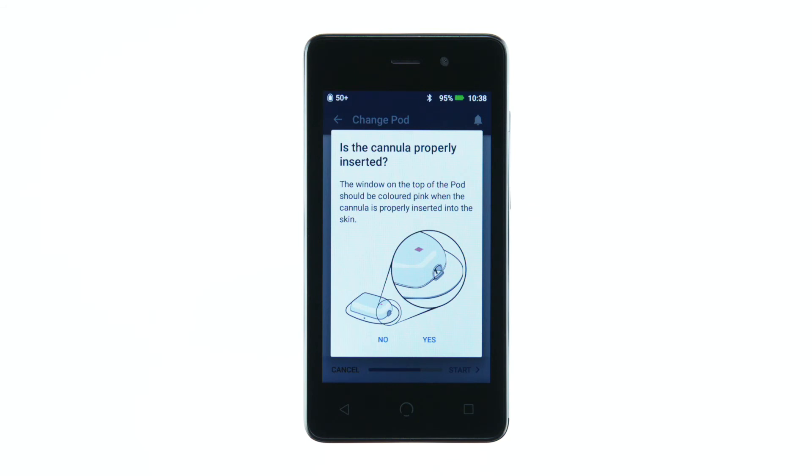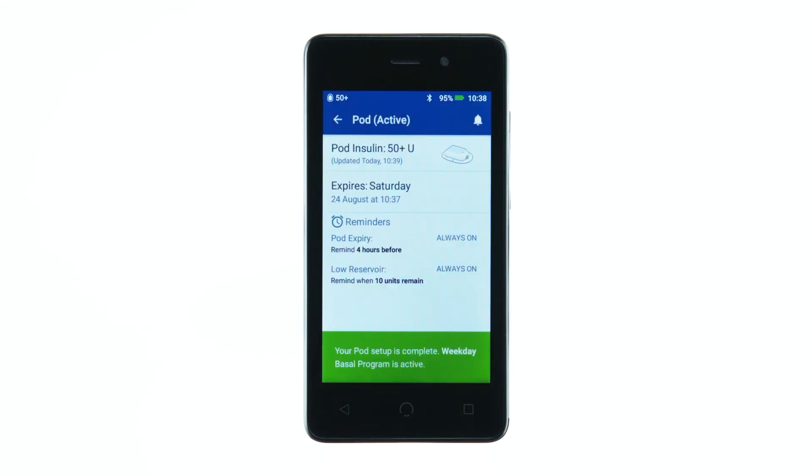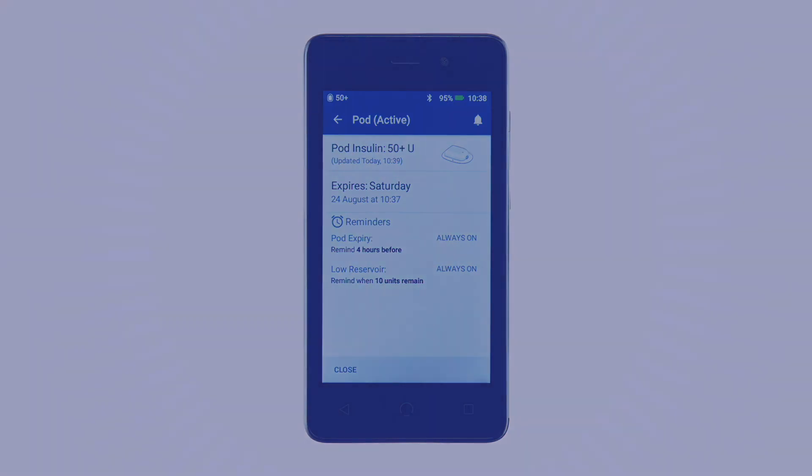If the cannula was properly inserted, tap Yes on the PDM. A green banner notifies you that the pod setup is complete.